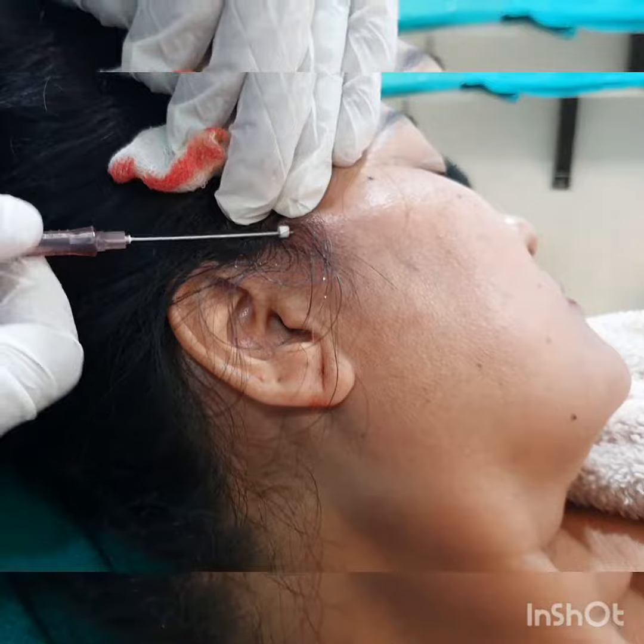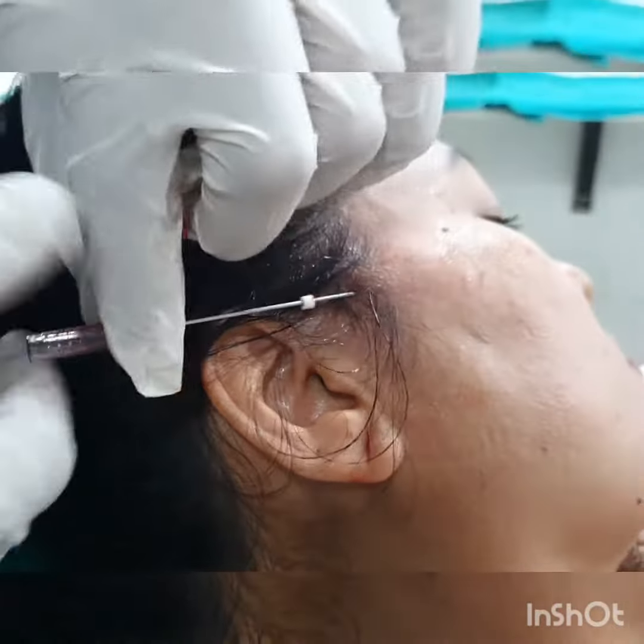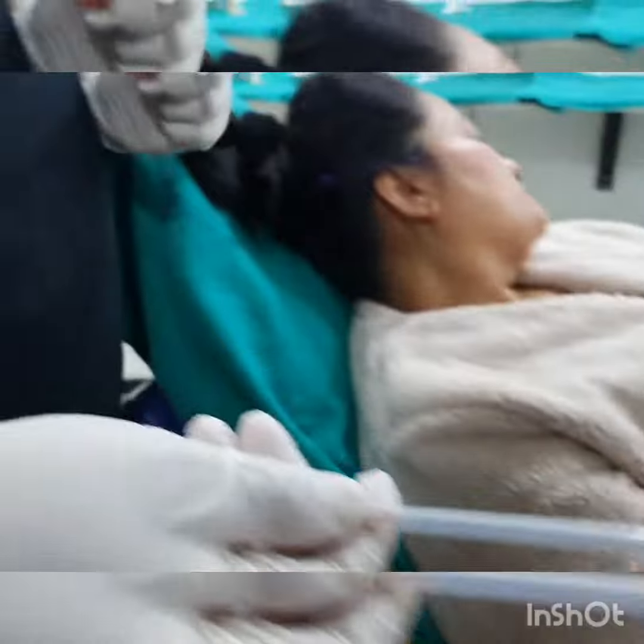I usually pass 3 to 4 threads each side. The first one is along the cheeks in order to pull the laughter line, and you will see how easily it goes in. The patient has no pain and hardly feels anything at all.